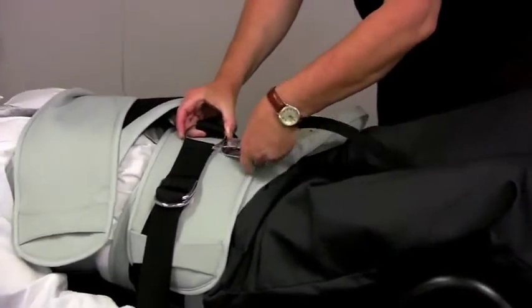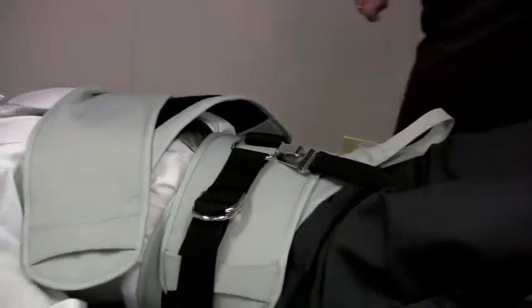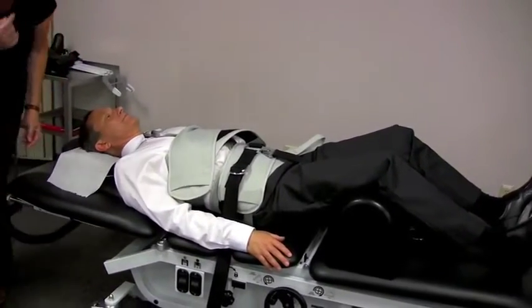And hook it, just slide it under, and it goes right on. Comfy? Yeah. Good. Now, would you like to lean up a little bit to watch? No, I'm fine. You're good? Okay. If I wanted to lean up the piece, let me just show it so these guys can see it.